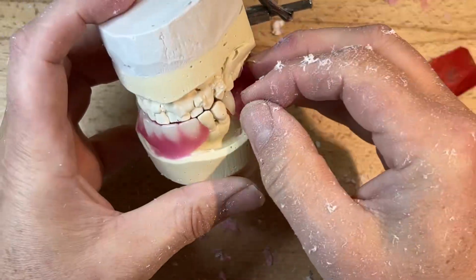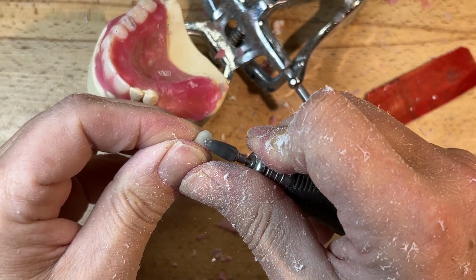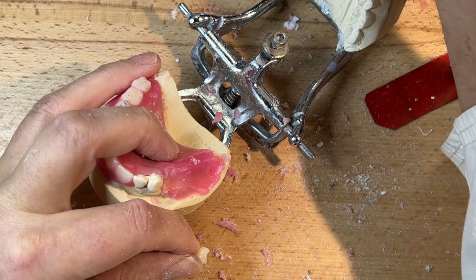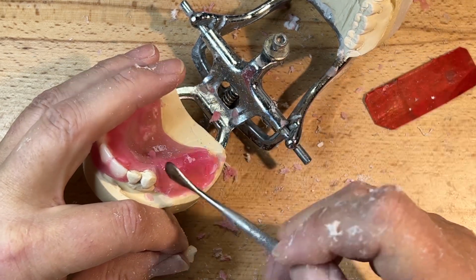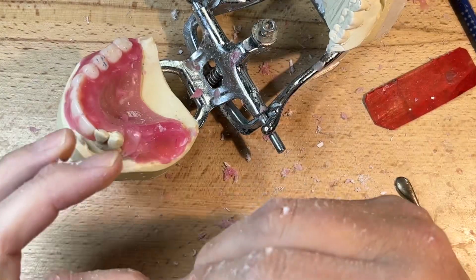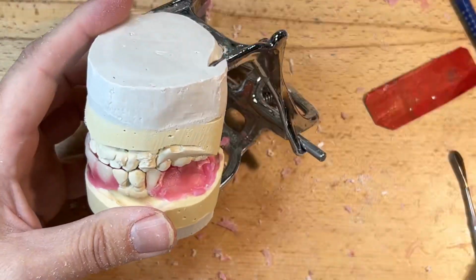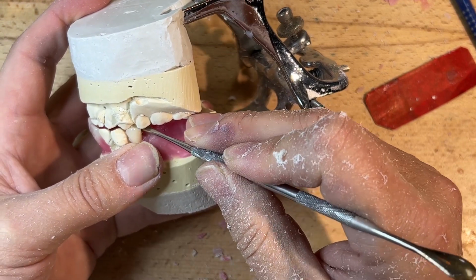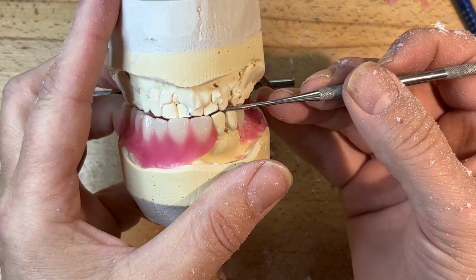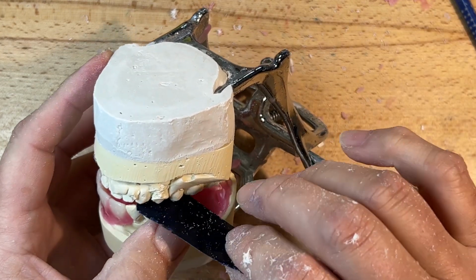Still got to reduce the distal buccal pit of number 4 to accommodate this sharp edge of number 5 below. If I wish, I could mark a line here and reduce number 5, almost like a reduction marking. And then during the try-in, I can reduce the existing partial denture at that moment in time. And I'm almost there while maintaining the same buccal overbite in the posterior, just a touch more. And maybe we can accommodate that sharp corner.